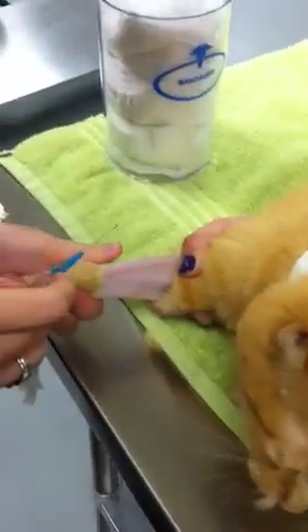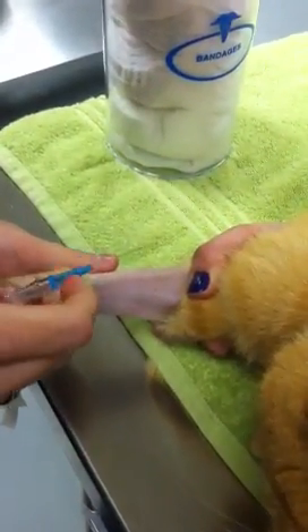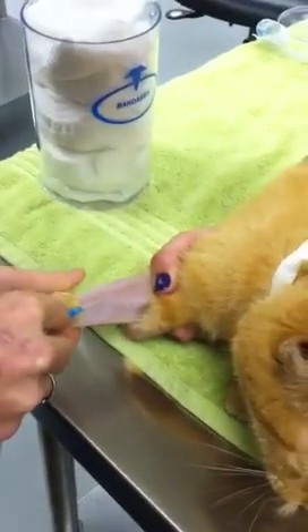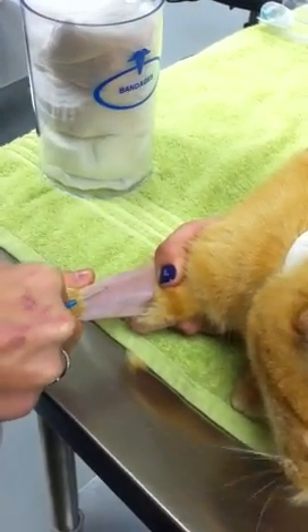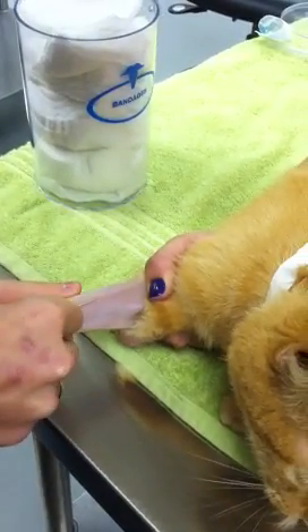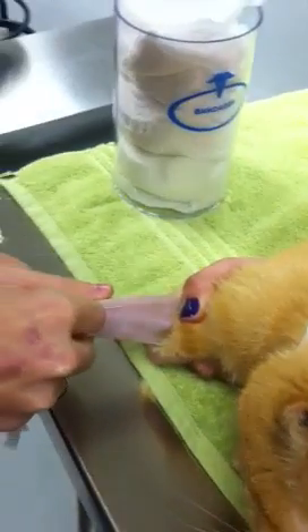Heather is holding off the vein for me and I have a nice clear shot here. I'll be going in bevel up. Waiting for my flash — I have my flash, so I'm going to push in just a little bit further.